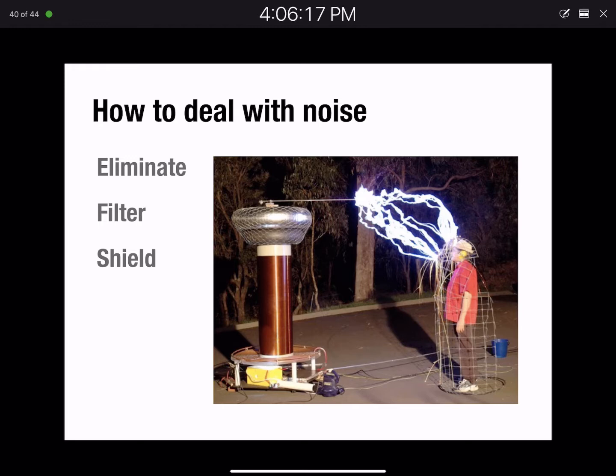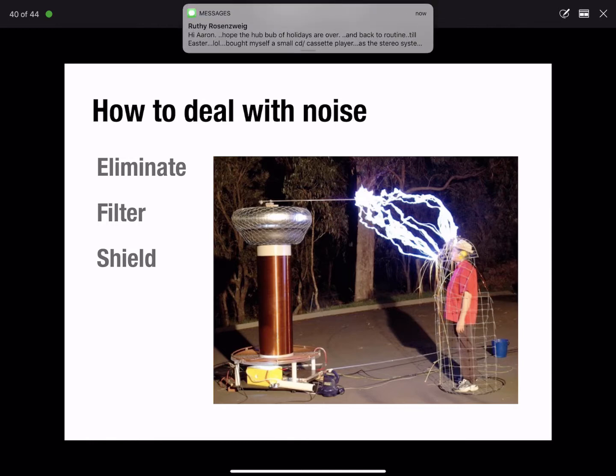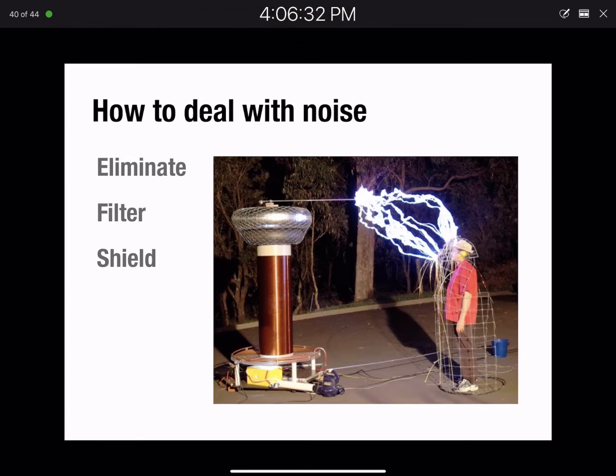In my lab, I have one of these, and then I have two other EEG systems that are just in average rooms without that kind of shielding, and the data are just as good from any of them. And in the booth where you're going to be doing your recordings, you'll also see that it's a Faraday cage. It's actually a homemade one. It was apparently built by a professor here at Dal many, many years ago, before my time. But it's a very well-built Faraday cage. It looks like crap. They put those old cardboard tiles all over it, but it's engineered very well.